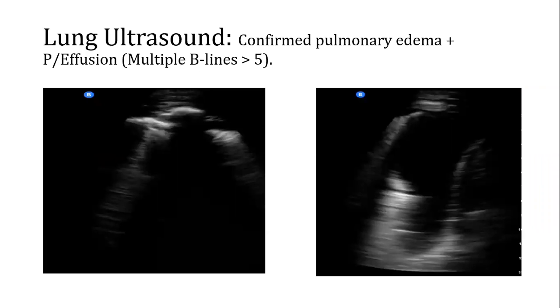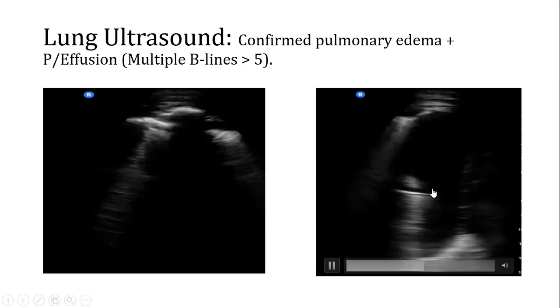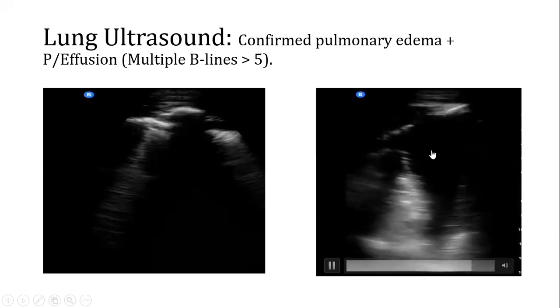So we started with a patient who was diagnosed with asthma, but the management did not work out. A chest X-ray was done. It did not show anything so remarkable until the D-dimers were done, and they were raised. Then the CT scan alerted us there's pulmonary edema and pleural effusion, and lung ultrasound is confirming, yes, there is pulmonary edema. And what you are calling small effusion is not actually small. This is about more than 3 centimeters deep.